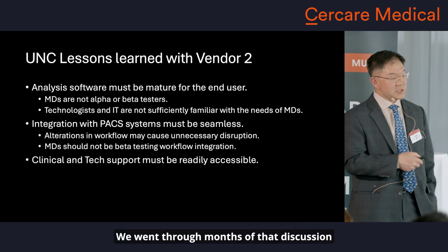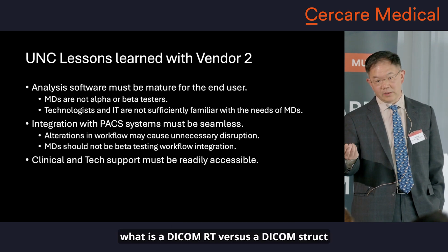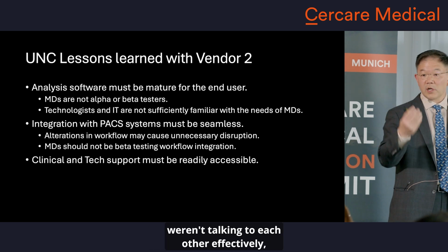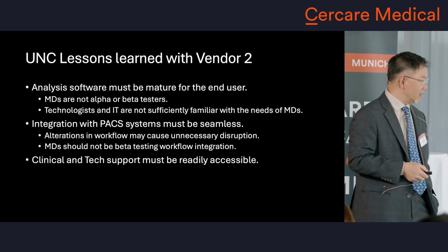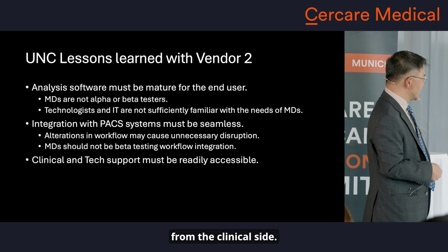We went through months of that discussion of how we're going to deploy this, which pathway, what is a DICOM RT versus a DICOM struct, and all those things. But clearly the two vendors weren't talking to each other effectively, and messages had to be passed through me to pass the message back. And I quickly got sick of that. And nobody in this room probably wants that responsibility from the clinical side.